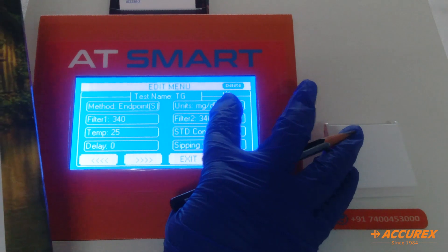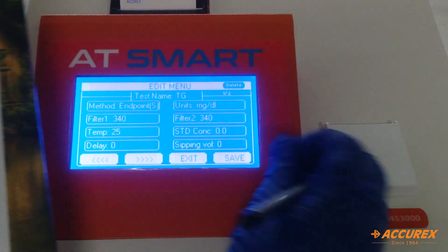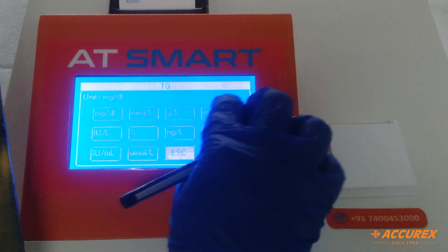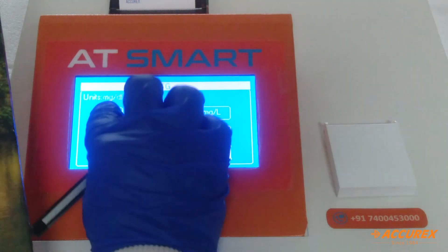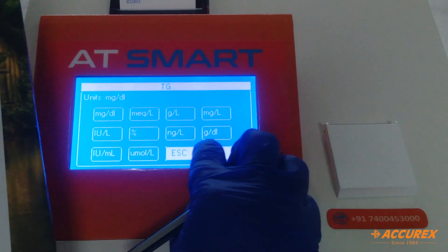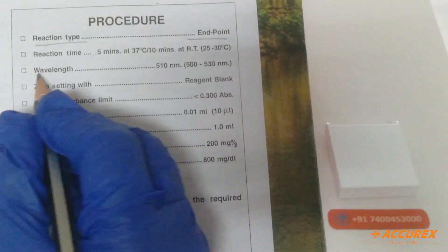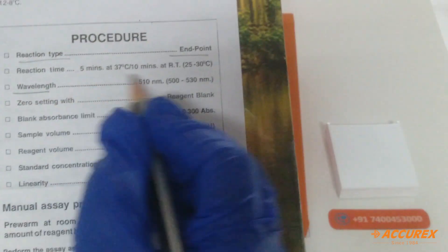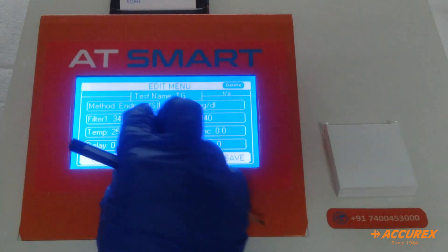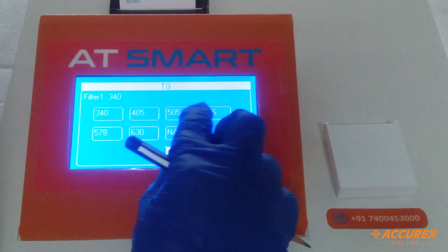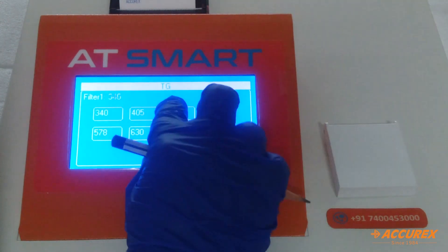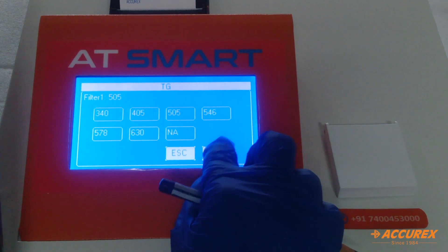Set the unit to mg per dL and save. For Filter 1, the wavelength is 510 — press 505 and save.